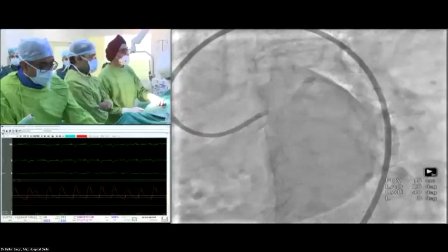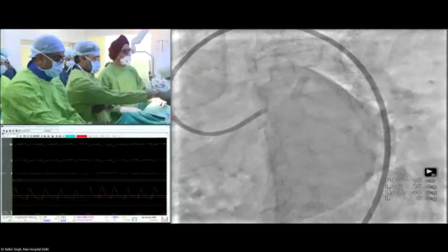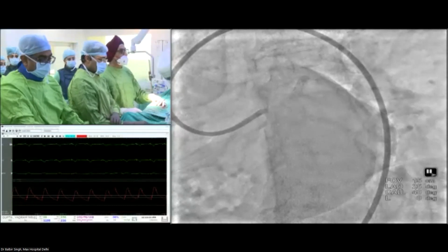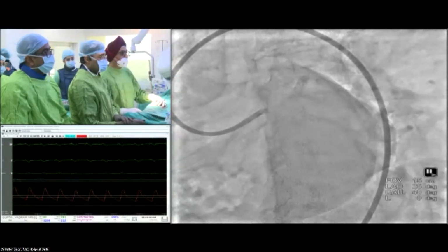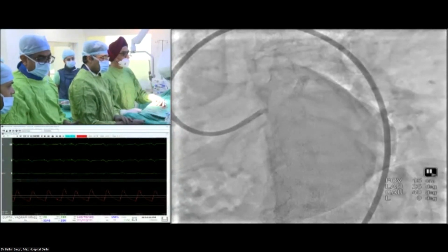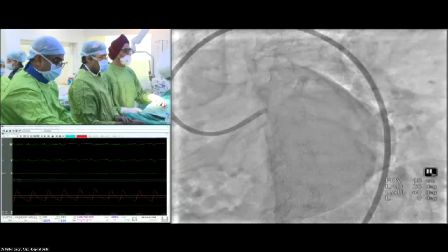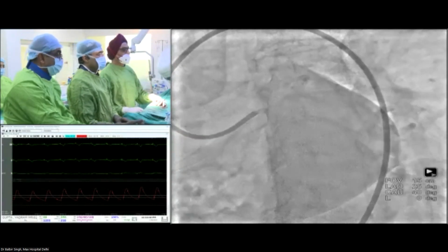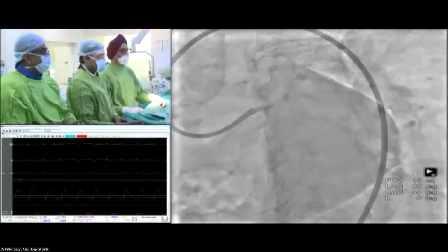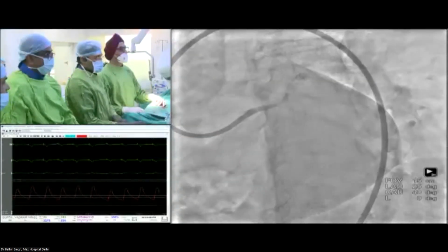This is now the current angio from today. So they put a stent into the circumflex ostium, trying to spare the LAD, without a kissing in the left main. And he came back within 5 years with severe symptoms. The symptoms have been there for 6 months. So we'll show you today's angiogram now. This is the old picture. Now you see today's picture.